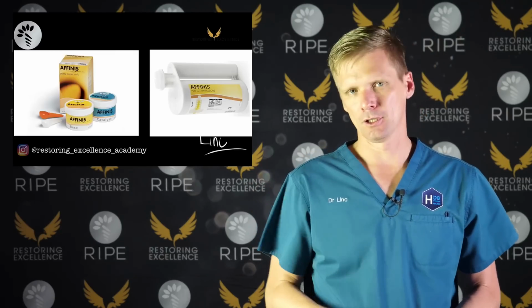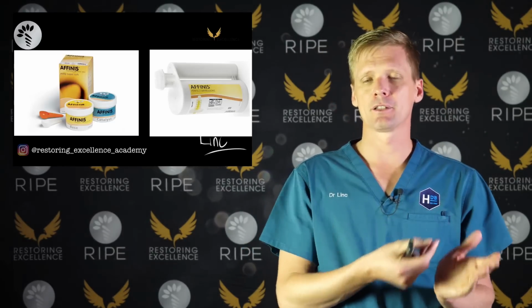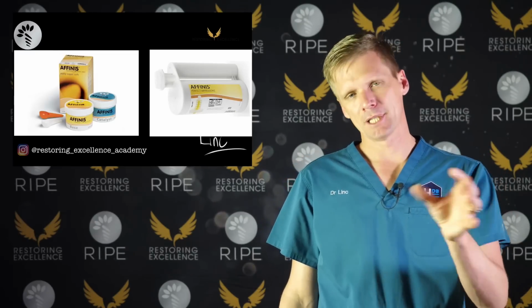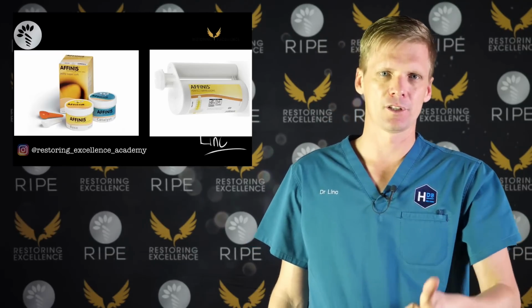Most of the time I'm going to use heavy body, particularly for veneers where you've got those little edges on, say, the lingual side of the tooth. You really want to use the most accurate material you can, so I would tend to use heavy body here, and the compression of putty is not as useful on veneers. In fact, it's much more likely to get a tear or a distortion.